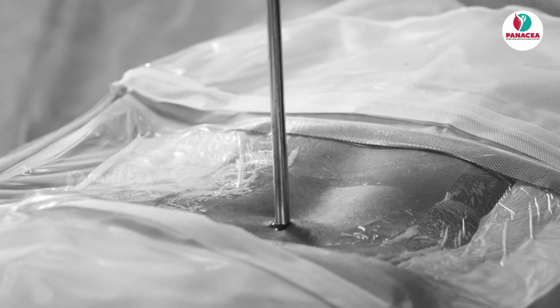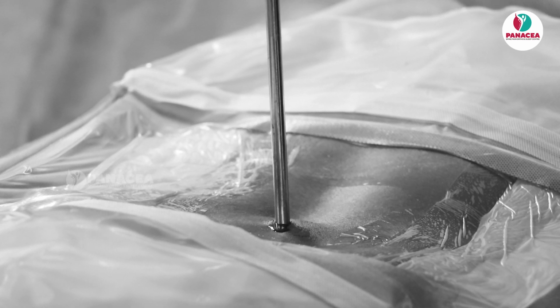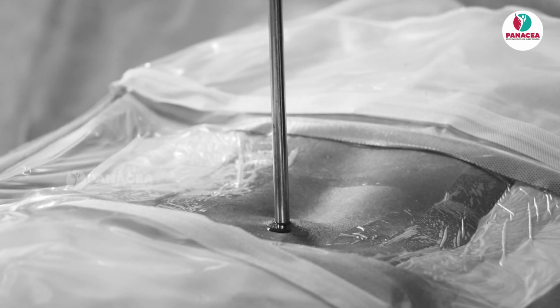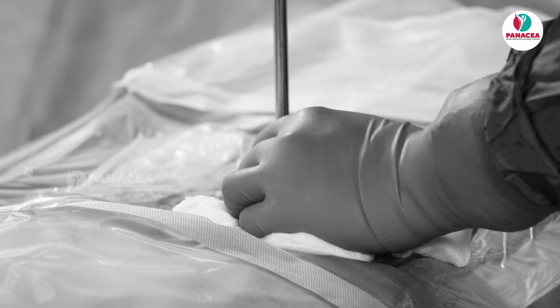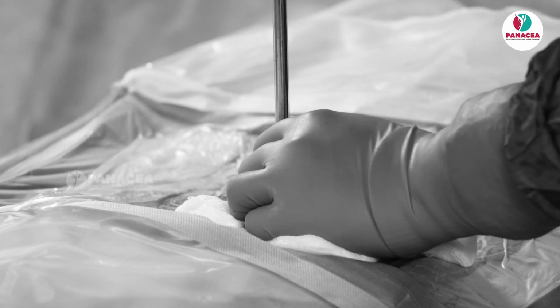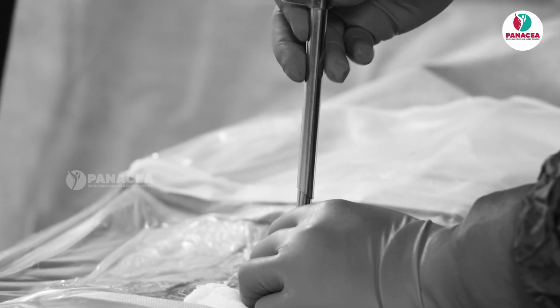We have placed the obturator, the dilator, inside. Exactly, our entry is at the spinolaminar junction since it is L4-5 and the window is a little small. I want to do a hemilaminotomy. That is my idea. So we have taken an AP shoot, then the sleeve, the working sleeve. This is a working sleeve. I am railroading it, and you can see here the bevel is facing towards the medial side. See, the bevel is facing the medial side.